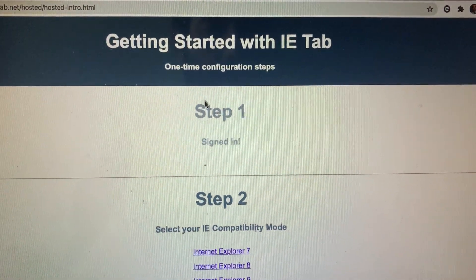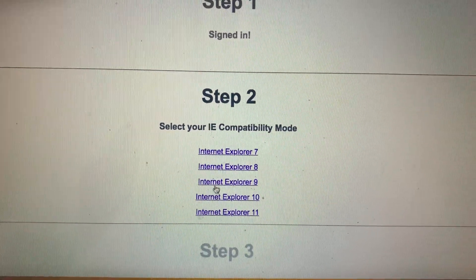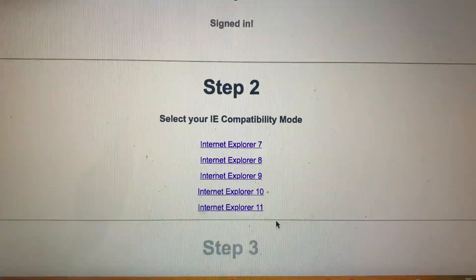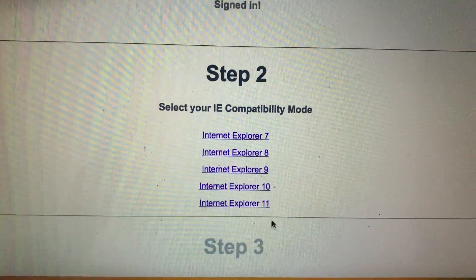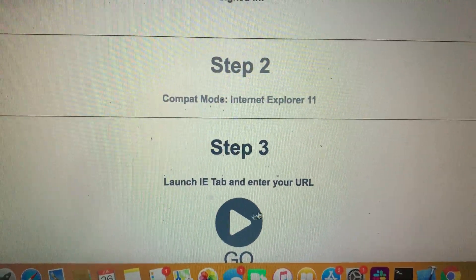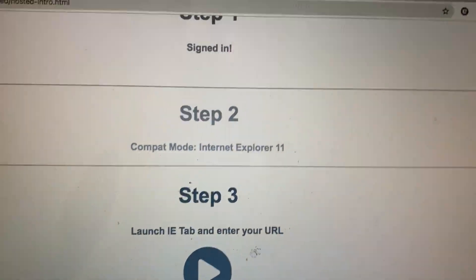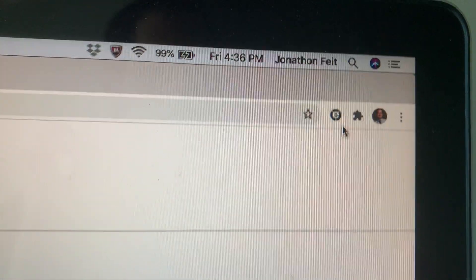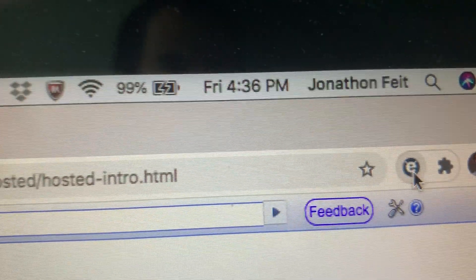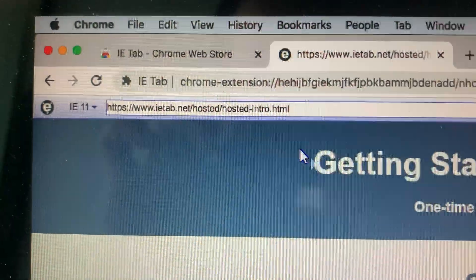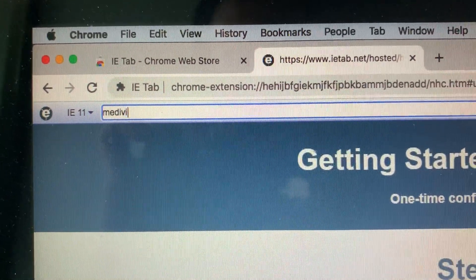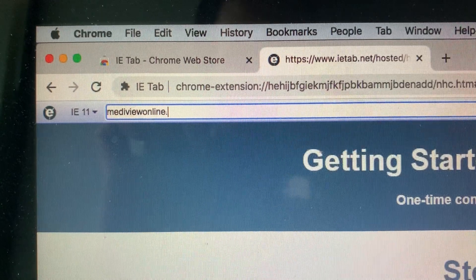What happens now is you're given the option to essentially run what looks like and feels like Internet Explorer inside the Chrome tab in a Mac environment. You have a variety of different options, and you can change this from inside the program anyway. I'm going to choose IE 11 — why not use the latest? IE Tab installs a little Internet Explorer-looking icon in the browser bar. I'm going to click that, and it opens up a browser bar into which I can enter my URL. So I'm going to go to mediviewonline.com.